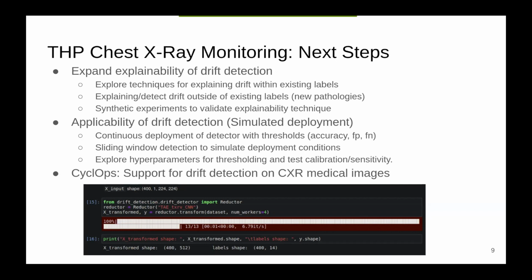I guess it's something like, if you compared, say, PCA to using the trained autoencoder, I should have mentioned the autoencoder is trained on open source chest X-ray data. So having a trained autoencoder that's capable of compressing things in the same domain as the data we're dealing with seemed like a smart direction versus, say, training a PCA on each image in particular. That just seemed intuitive in a way.